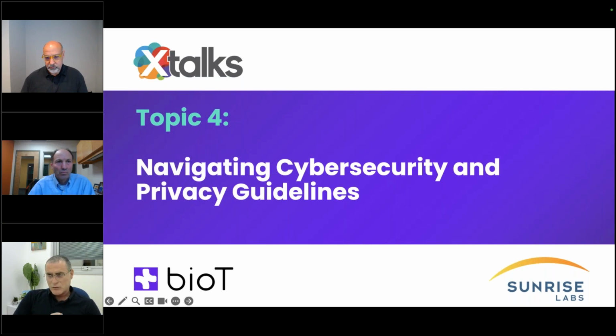Again, be ready for multiple situations, because the regulations in China or Canada and the US are different with respect to what is considered private information and how you can share it. Another important point is that not only on your main cloud infrastructure, where you are managing and collecting the data, do you need to comply, but also on third-party tools that you are using.